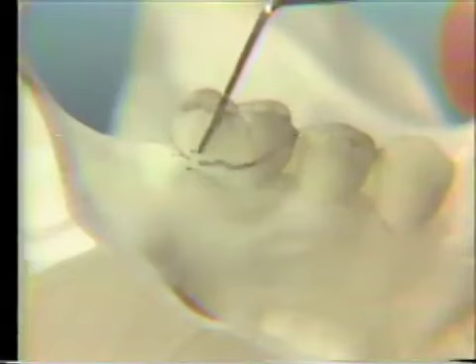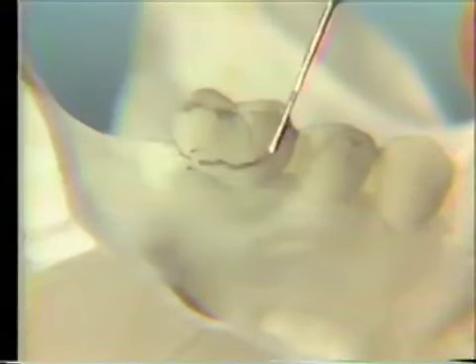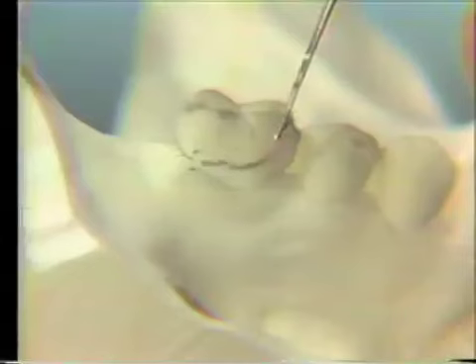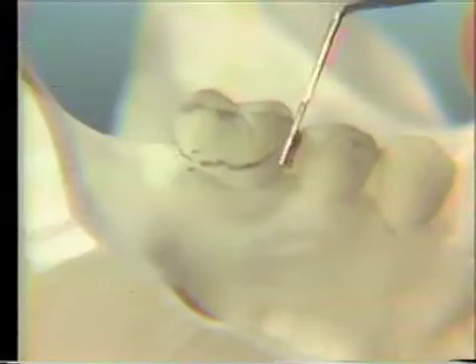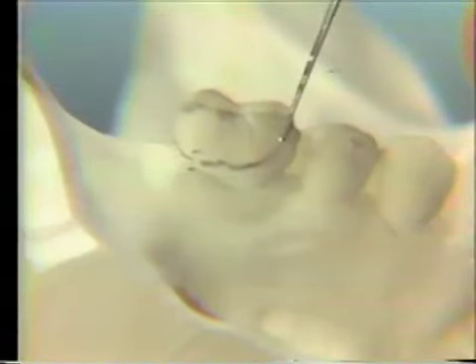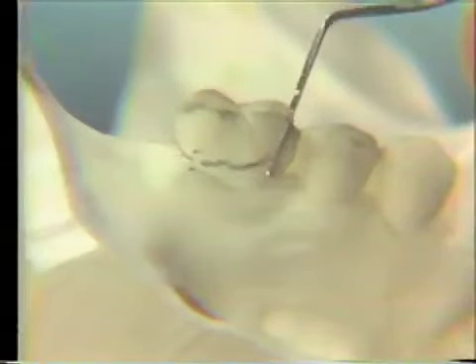And we see that this buccal surface is of nice contour because the height of contour is low back here and it swings up, and so our clasp could lie above the height of contour till it reaches the retentive area on the mesial buccal and then would go into this undercut. So when the restored crown is waxed up, this tooth has a faulty amalgam, remember, we can move the height of contour up maybe just a slight amount, or bring it out just to increase our retention, over-contour it slightly, but we'll want the general contour of the waxed crown to be the same as is shown here.